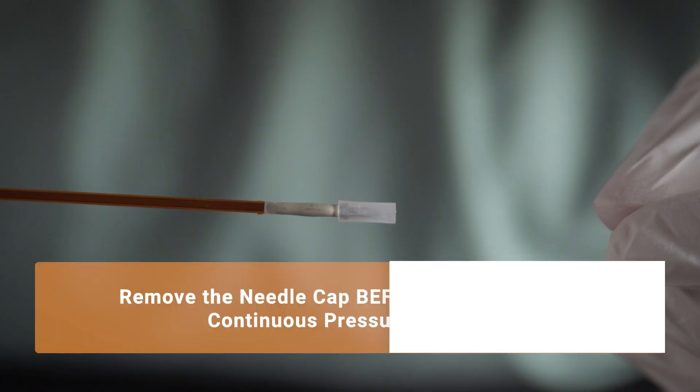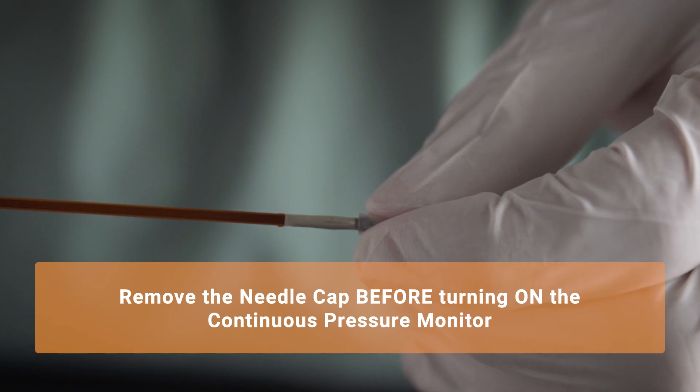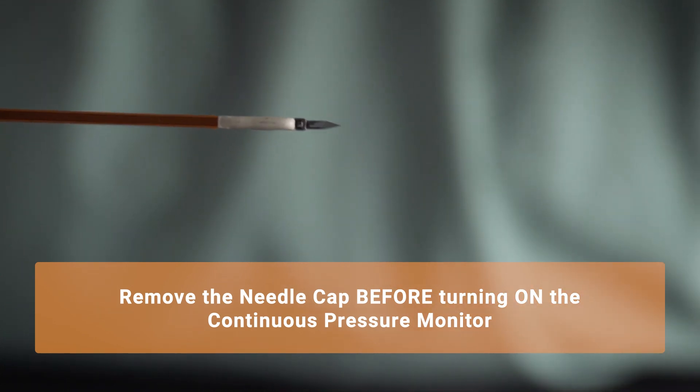Remove the protective needle cap before turning on the device to ensure that no pressure is applied to the sensor when the device is self-calibrating.